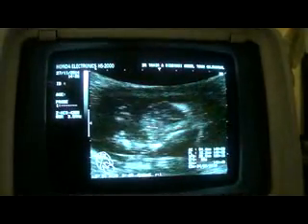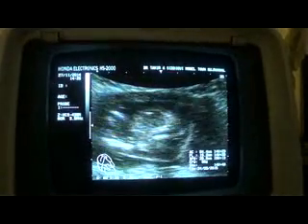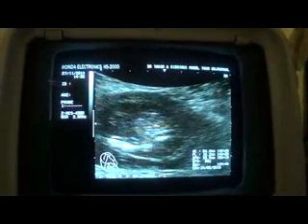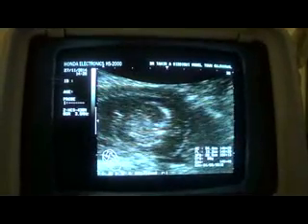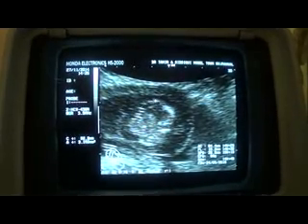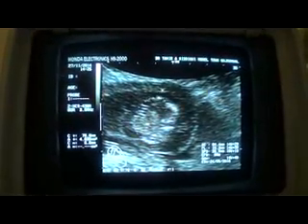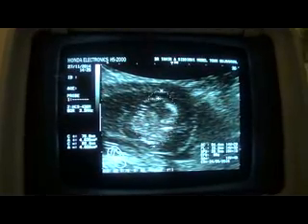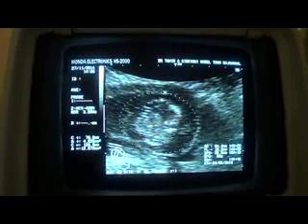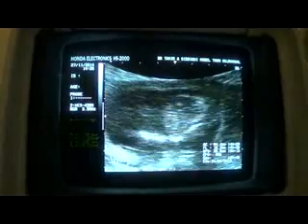Now note another anomaly, another feature that should be considered. First, the body of the fetus is also enveloped by a rim of edematous skin. You see, this is the fetal body in transverse section roughly, and this is the fetal edema. Abdominal wall edema. This area is consistent with fetal abdominal wall edema. Okay.